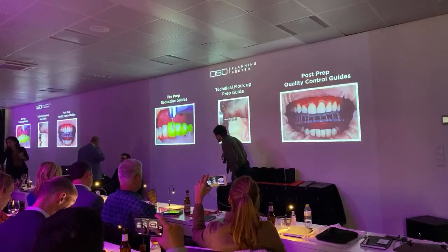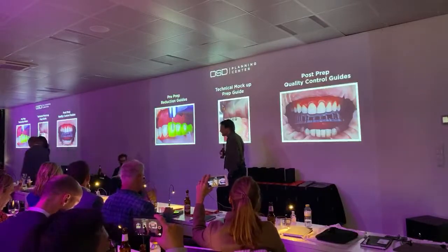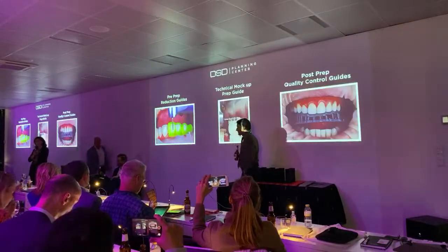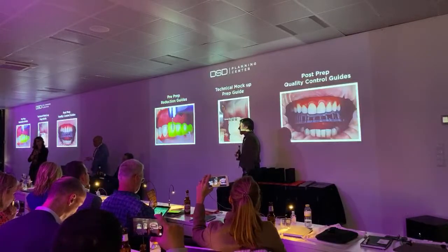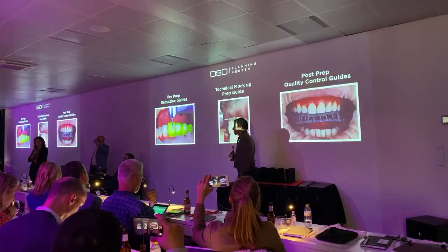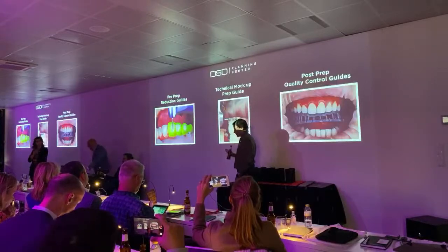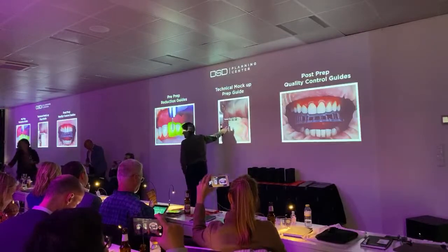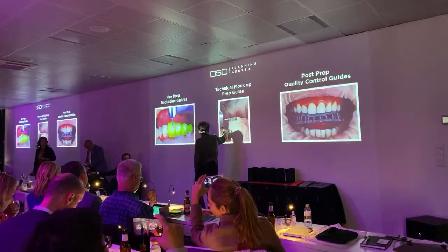When you mill a restoration, the burrs have to fit within the parameters of the porcelain. And so sometimes there is a discrepancy between a milled restoration and a pressed restoration. That is the thing that I have the biggest challenge with, because I want it to match the ideal. So I get lost sometimes in where I am. Now you're not going to get lost in the reduction. Place the mock-up in. Do the grooves. Smooth out the grooves.